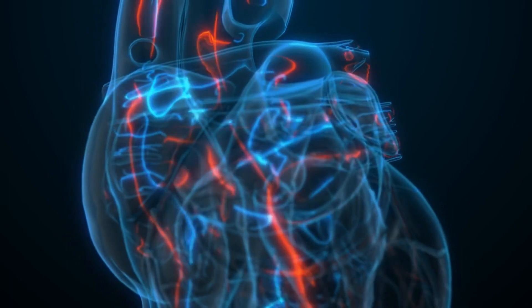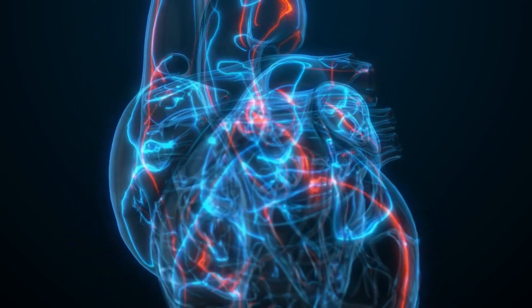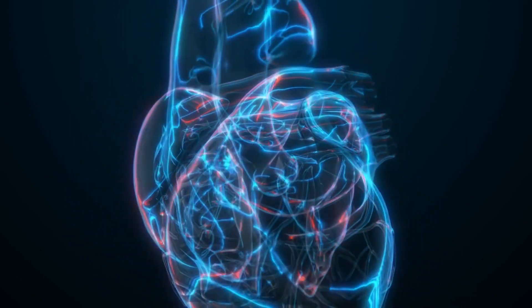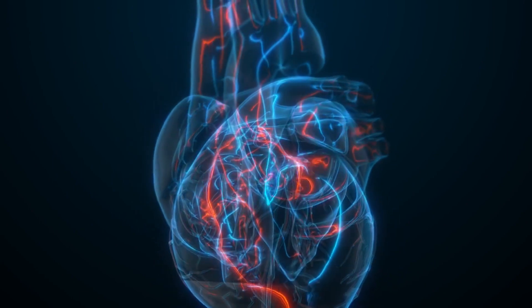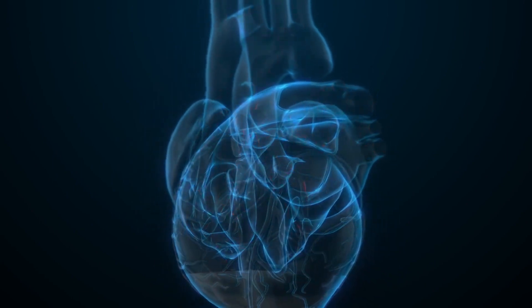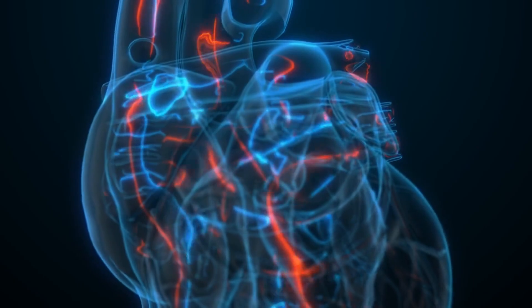Overall, a peripheral angiogram with intervention is a valuable tool for diagnosing and treating conditions such as peripheral artery disease, which can cause reduced blood flow to the limbs and lead to pain, numbness, and other symptoms.